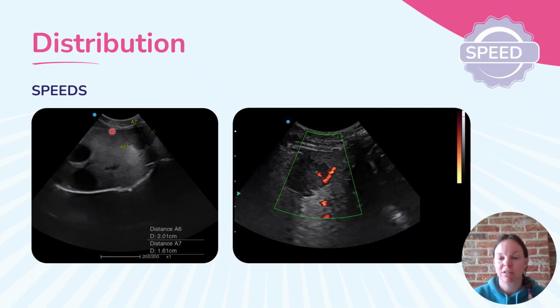So thinking about the size, height, width, depth. So we really need to get 3 planes to understand, or 2 planes, 3 measurements to understand how big this lesion is. That measurement is really key because if you don't do any further treatment, a potential monitoring technique will be to see if that changes in size, but we really need to have monitored and written down that measurement.